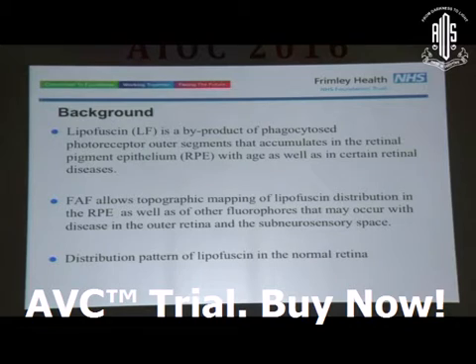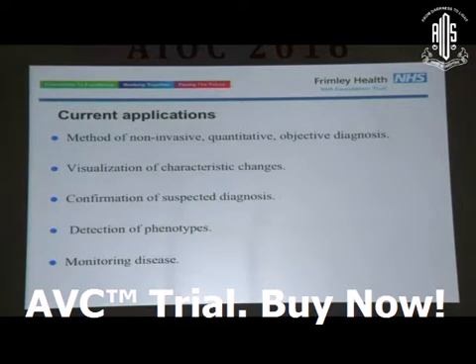FAF allows the topographic mapping of the lipofuscin distribution in the RPE as well as of the other fluorophores that may occur in disease in the outer retina and the subneurosensory space. So to understand autofluorescence, we do need to understand the distribution pattern of lipofuscin in the normal retina.